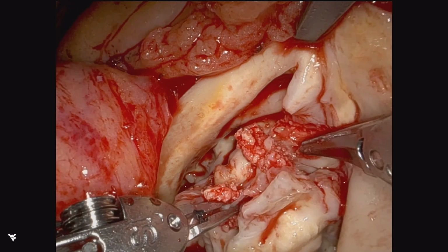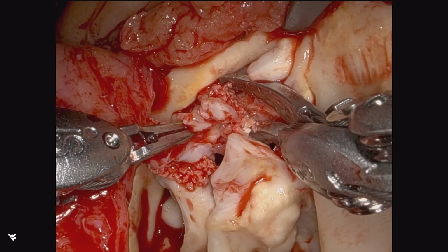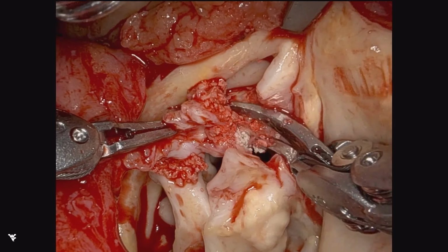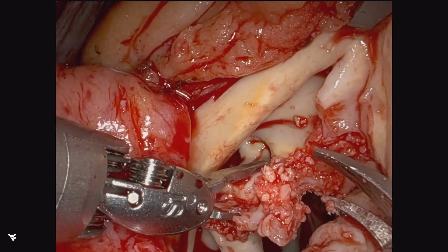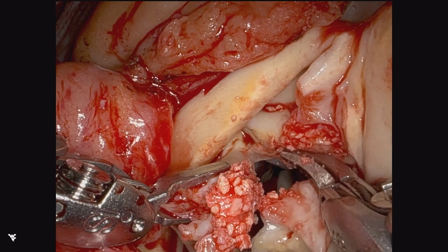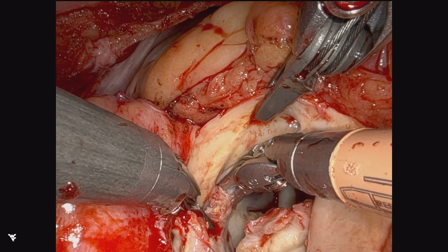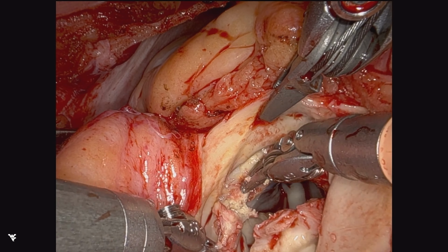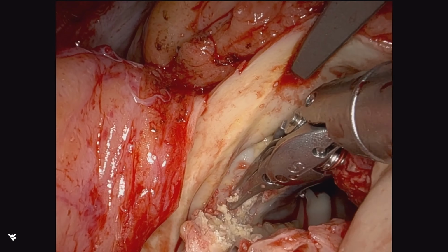So exposure, and how we're starting to get into the situation where the patient's calcium is fairly extensive and entering into the left ventricular outflow tract. We have tandem partnership with the suction aspiration to really stay very flush with the annulus, as it is very important to avoid paravalvular leaks and have a good, durable, long-term result, to really remove as much, if not all, calcium as possible.